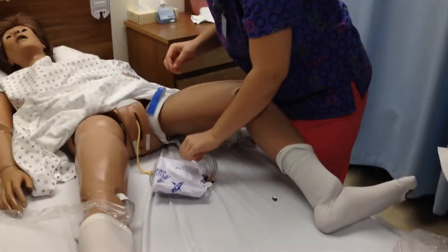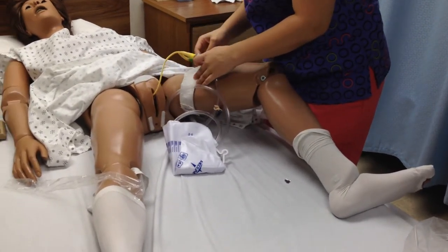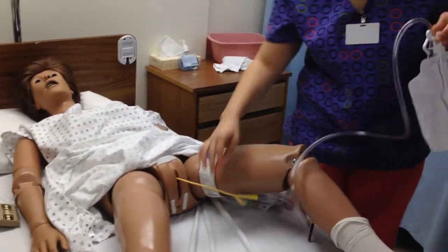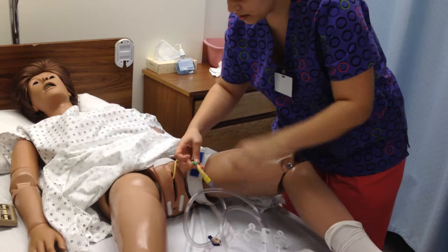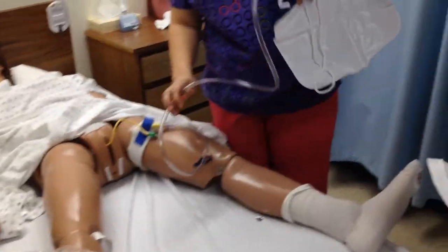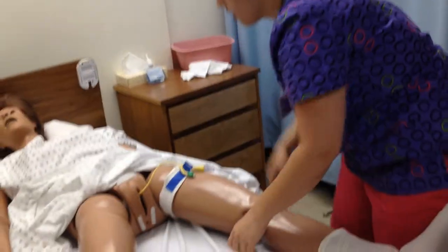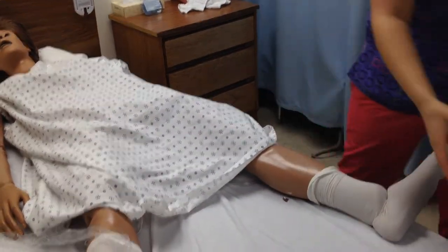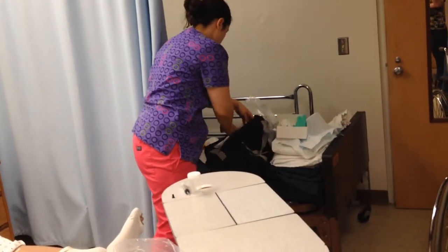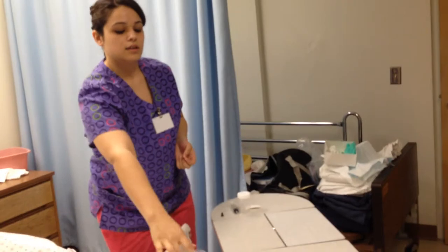Then I would put clean gloves on and wash my hands. And I would take this and secure it to the leg, but at the Y, make sure it wasn't able to move. Now I'm going to take this and hook it to a non-movable part of the bed. Up. And now I'm going to get my stuff ready for the specimen and the removal.